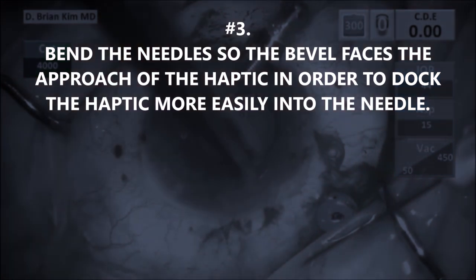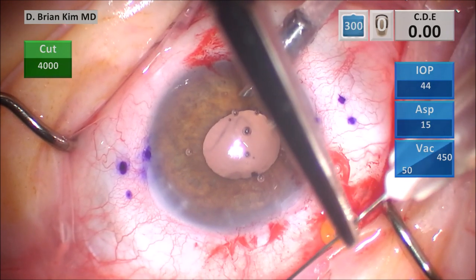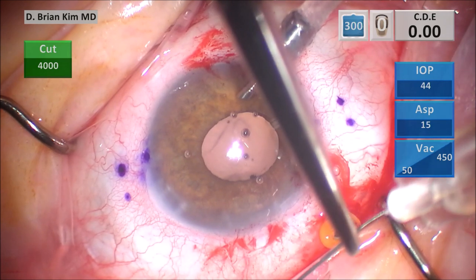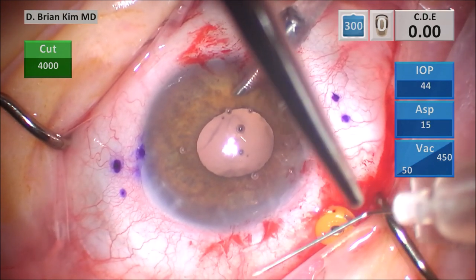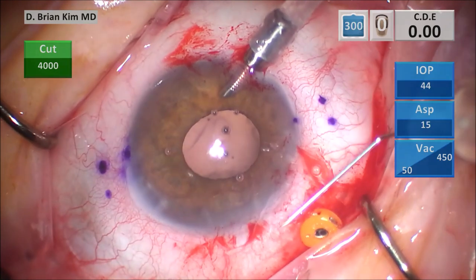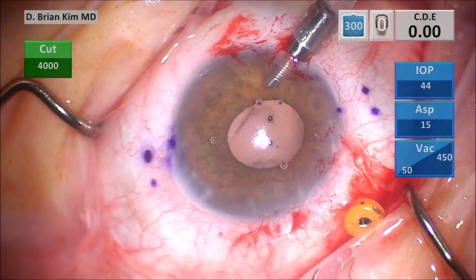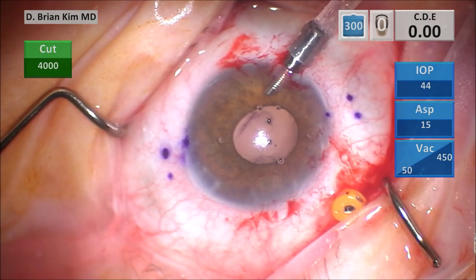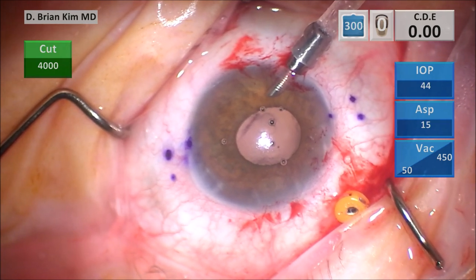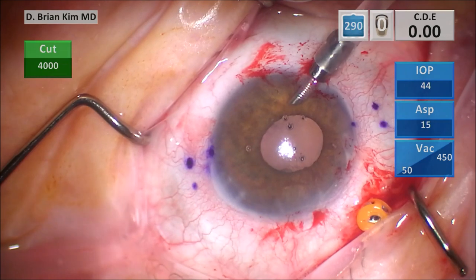Number three: you want to bend the needle so the bevel faces the approach of the haptic in order to dock the haptic more easily into the needle. This is very important because as you're bending the needle, you have to be strategic — once you place the needle into the sclera and you're ready to go, if the bevel is facing the wrong way, you basically have to start all over. For the right needle, I like to bend it about nine millimeters from the tip, about 70 to 80 degrees. Simulating how I'll hold it in the eye, the bevel is facing towards me. So the right needle faces towards me; the left needle I'm bending at the hub and it's going to face away from me. In both cases, it faces towards the approach of the haptic. Those incisions are so I can place iris hooks to better visualize when I place the haptic into the needle.